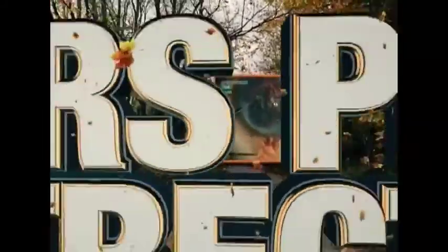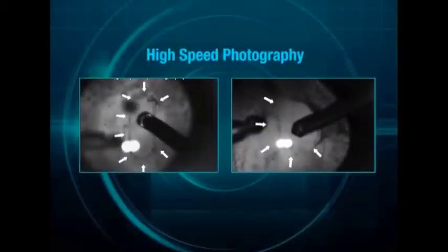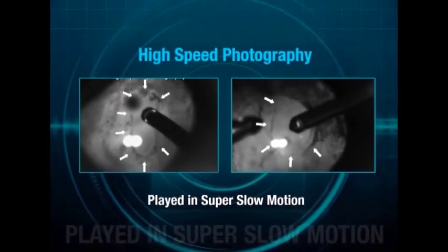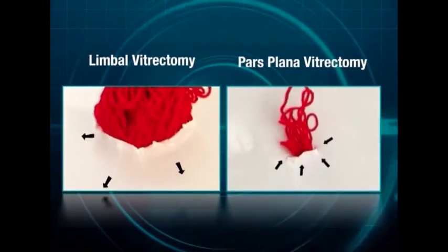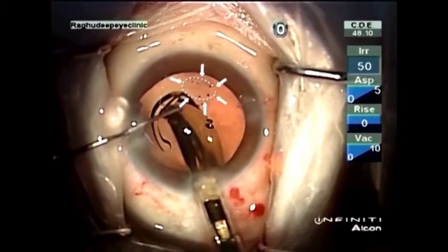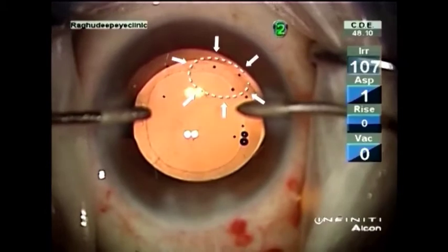In our pursuit for excellence, we have shifted from a limbal approach to a pars plana approach to adequately remove vitreous from the anterior chamber and around the posterior capsule rupture without enlarging the rupture. This is taking us closer to our goal of in-the-bag IOL implantation.